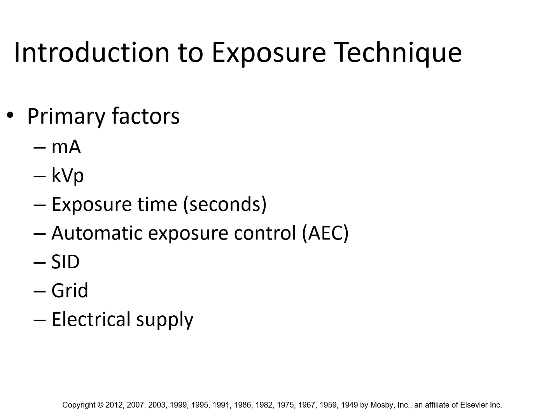SID, I introduced that term to you the other day. That's called source to image receptor distance. We are going to wear out the term SID in the procedures class. Okay, typically it's standardized to 40 or 72 inches. And remember, increased SID is inversely proportional to intensity.